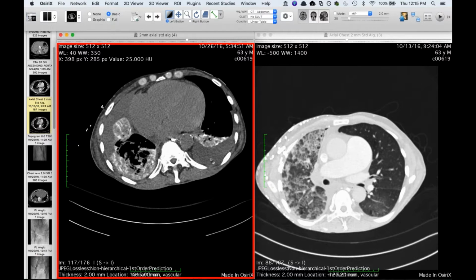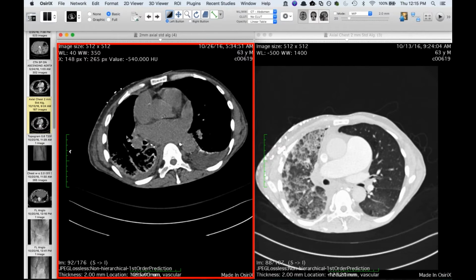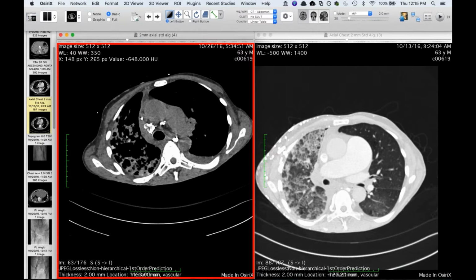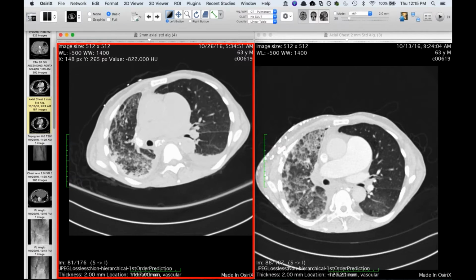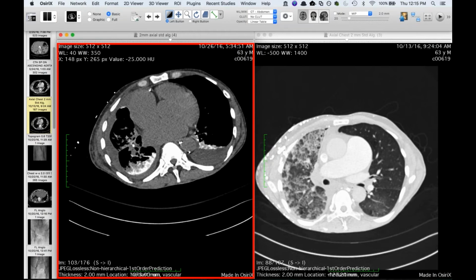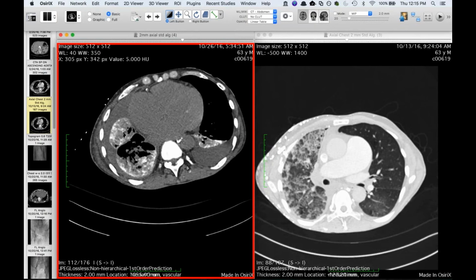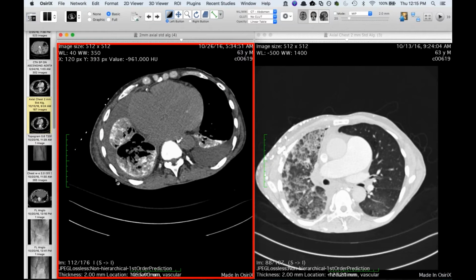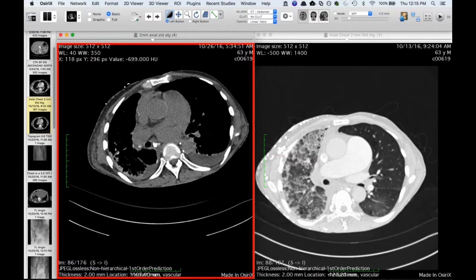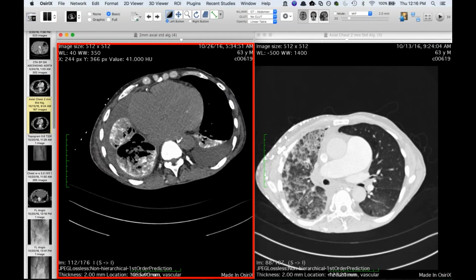granted the lung is more collapsed, but it almost looks like you can tease out interlobular septae here. So you're wondering if there's some lymphangiectasia throughout that lung, and you have these dilated channels that permit the stuff to just move out retrograde into the lung. Right, which would also be why he has this chylous effusion, I guess, if he's just got lymphatic obstruction.